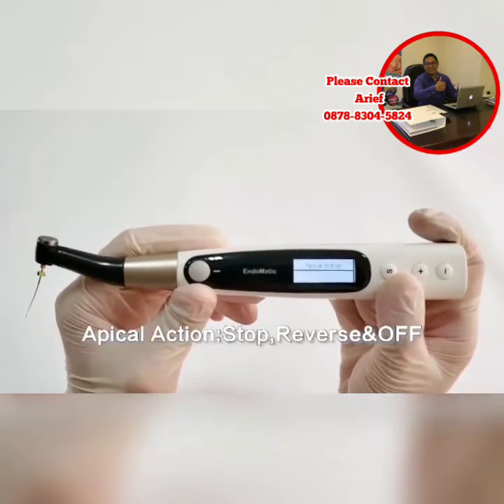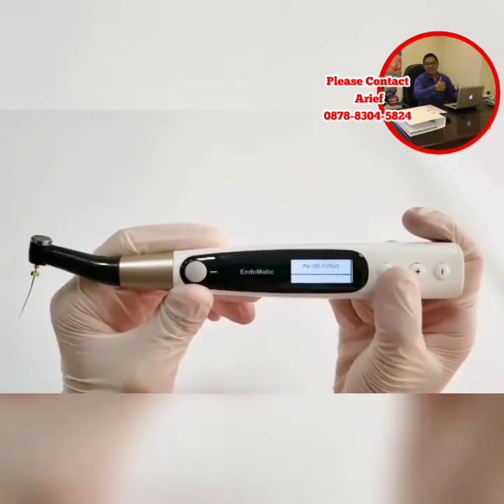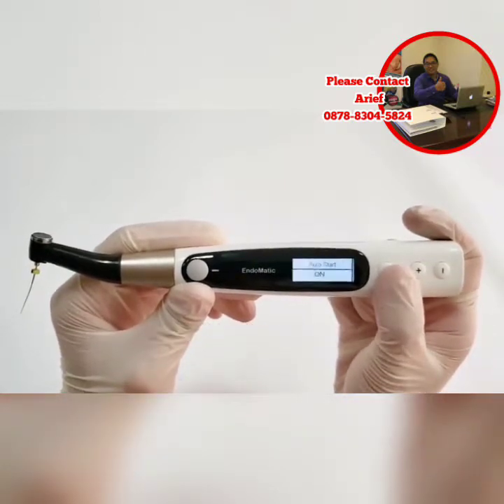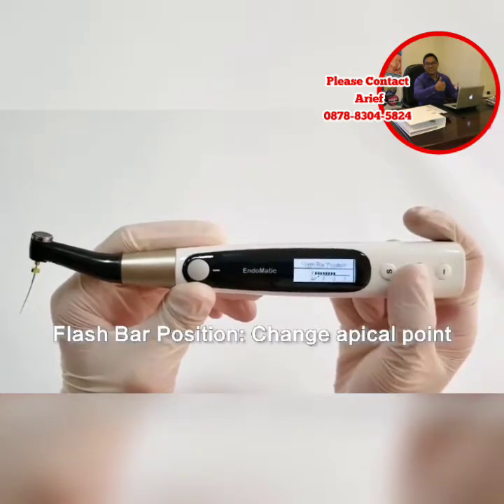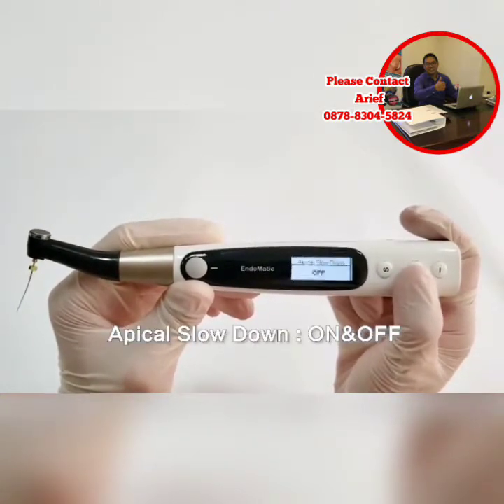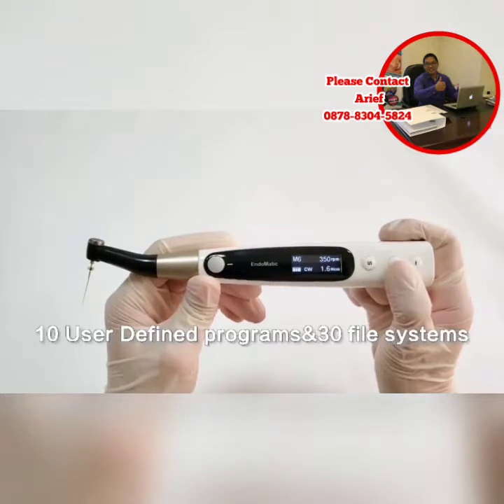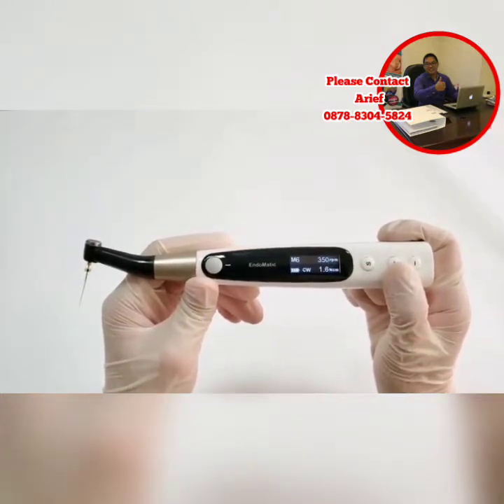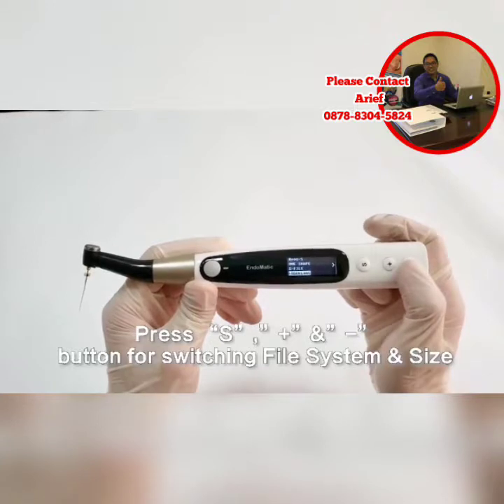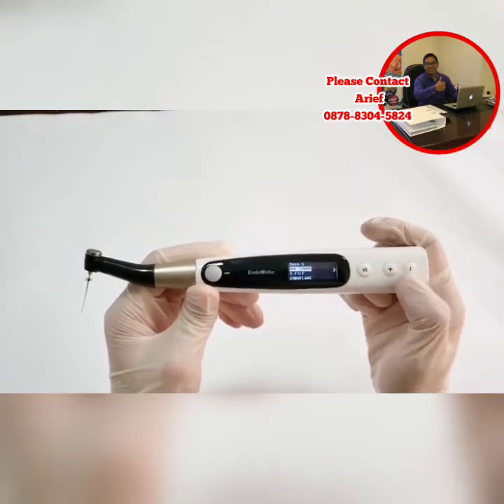The next mode is apical action mode, including Stop, Reverse, and Off. Then next is auto start mode, including On and Off. Next is flash bar position, to change apical point. Apical slowdown includes On and Off modes. The memory includes 10 preset user-defined programs and 30 file systems. You can select a different file system according to your demand. Long press the S button for one second, then you can select these 30 file systems and file size by pressing the S button and the minus and plus buttons.